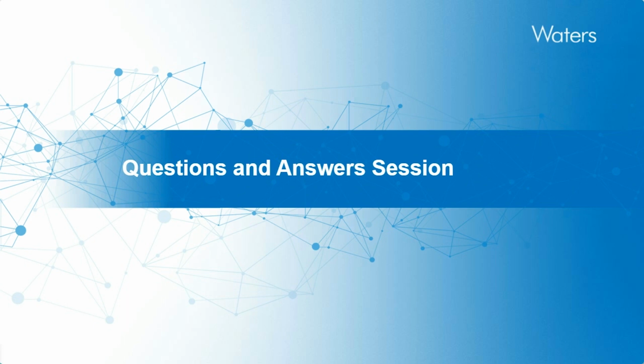So we take that mean measurement from the EQA scheme and compare it to the calculated concentration using our methodology. I believe that is maybe the correct answer in regards to the question, but if you do want to follow up on that, then feel free.